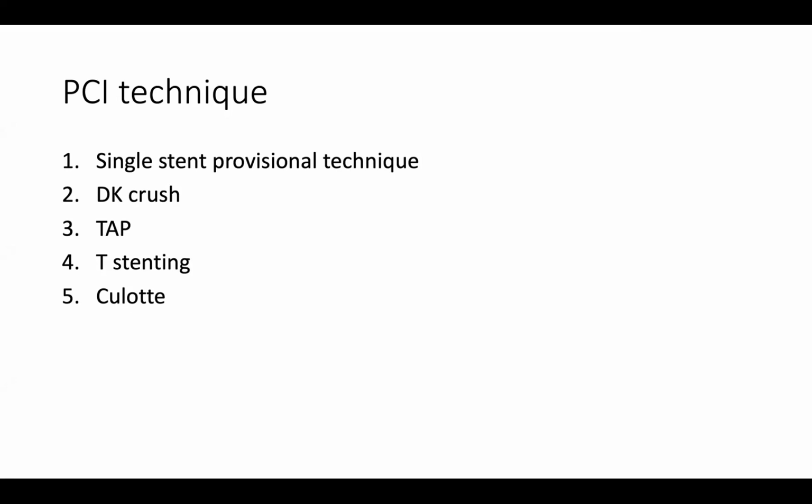This is what people have said. So most people have gone for DK crush. I don't know, they're well educated. Some have gone for single stent provisional. Want to keep it very simple. DK crush is a very sexy terminology, but honestly, I don't see many people use this one.